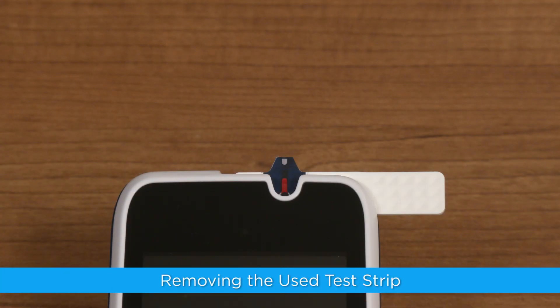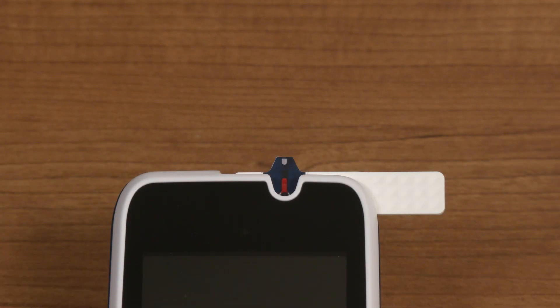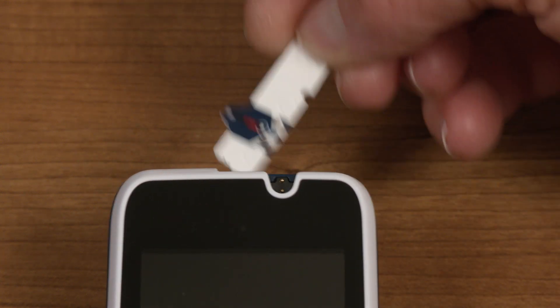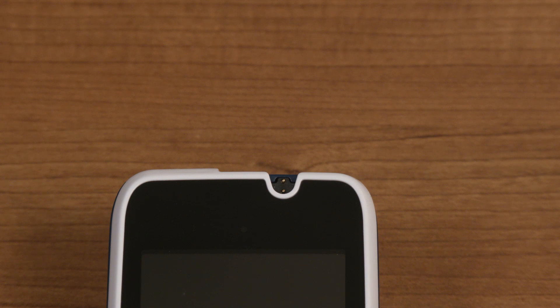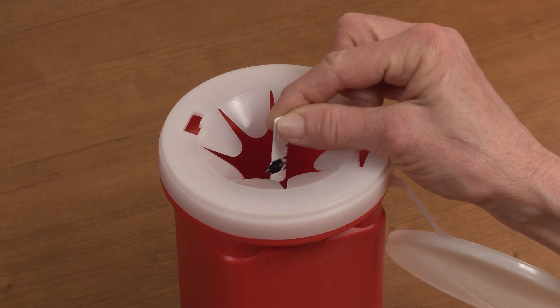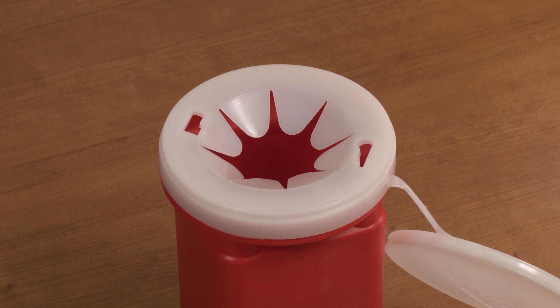To remove the used test strip, hold the test strip by its right edge. Rotate the test strip upwards while simultaneously pulling up. This will allow you to remove the test strip out of the test strip port. Once you have removed the used test strip, discard it in a sharps container or per your state's guidelines, just like you did the used lancet.